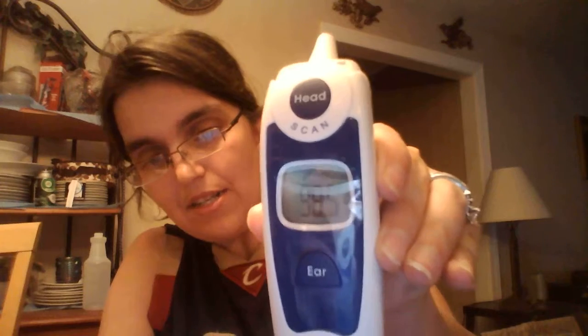Now I do have two older children, eight and nine, and what I do is that they can use the ear one. There is a button right here that says ear. All you got to do is stick it in — it's clean, I use alcohol wipes to clean it. And it says 98.2. All you got to do is one touch the ear and that's it.